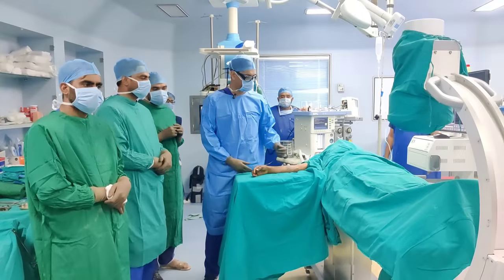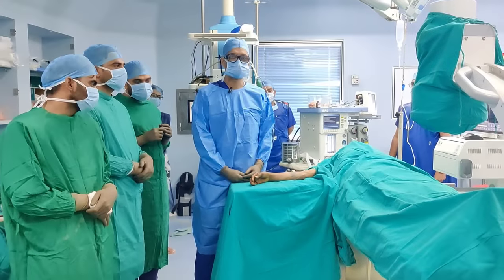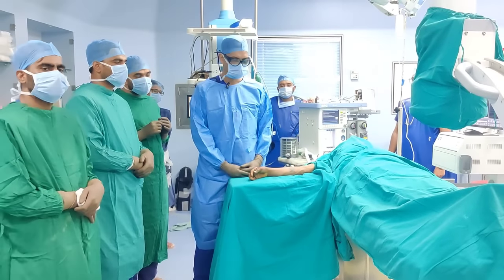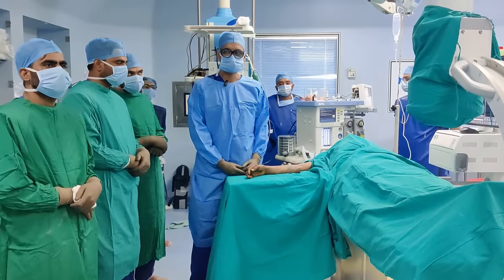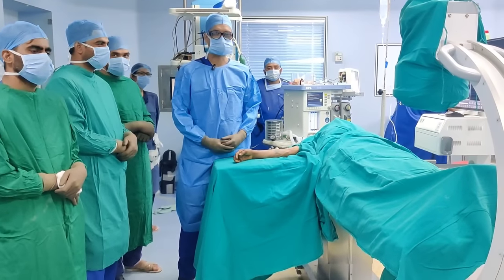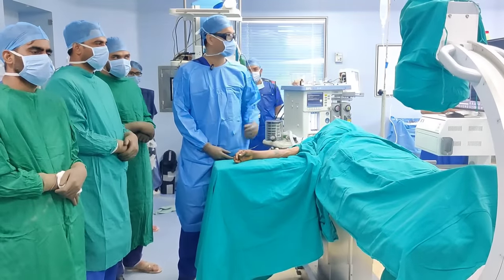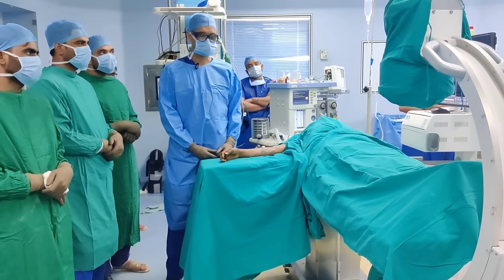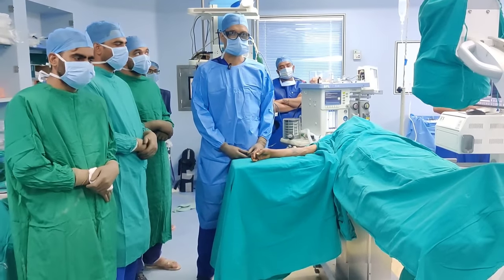We are ready now. The patient is positioned supine. We have angled the table slightly — it just gives us more space to work. We do not need a tourniquet because we are not planning to open anything, so tourniquet is unnecessary. My trolley is on this side. I have got Nitesh, so one person can hold the reduction and another person can fire the wire. The C-arm is going to come from this end and the C-arm screen will be right in front. This is our theater setup.